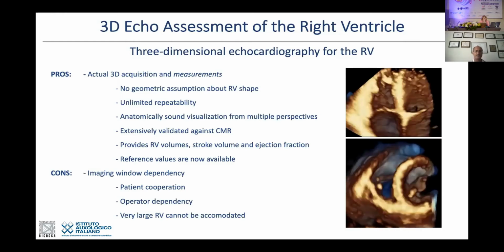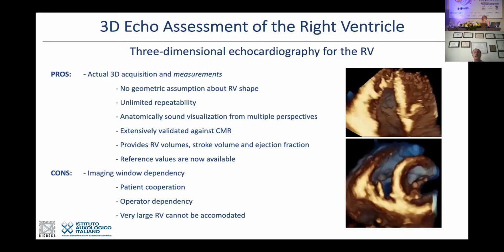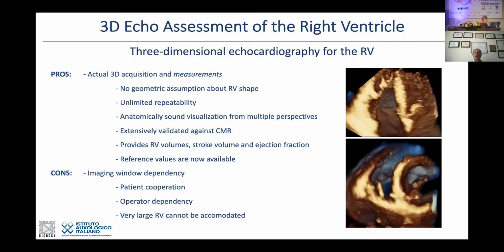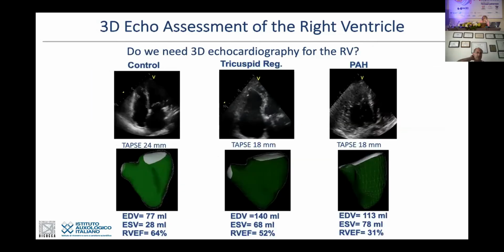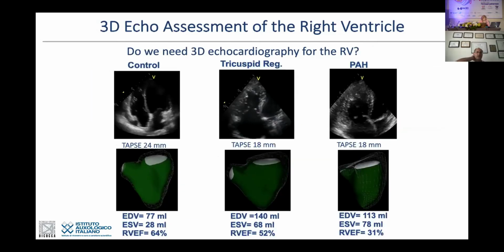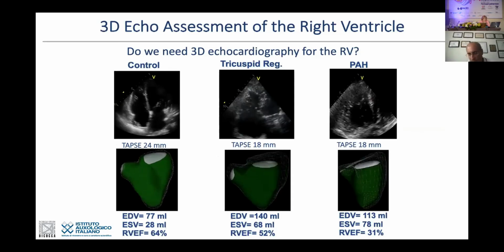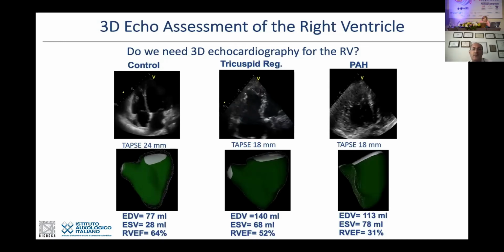Of course, it's an echo technique, and like all the echo techniques, it's dependent on the acoustic window and patient cooperation to obtain the best of the images. But it is worth doing that, because compared with the conventional parameters like, and here I provide you an example of the most popular one, the TAPSE, this provides many more information.